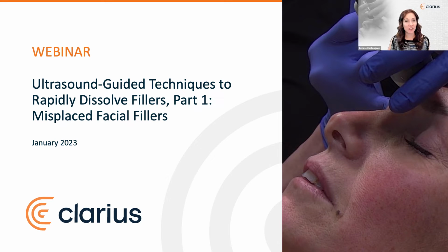We're excited to see you all here for today's live webinar, Ultrasound-Guided Techniques to Rapidly Dissolve Fillers Part 1, Misplaced Facial Fillers. Today we'll be joined by renowned medical aesthetic expert and educator, Dr. MJ Rowland-Warmann, as she teaches simple techniques for identifying misplaced facial fillers and treating them efficiently under ultrasound guidance. Dr. MJ considers ultrasound the most groundbreaking development in aesthetic medicine since the invention of filler. You'll learn the basics of dissolving misplaced facial fillers under ultrasound guidance, keeping it achievable and attainable for everyone from beginners to seasoned aesthetic practitioners.